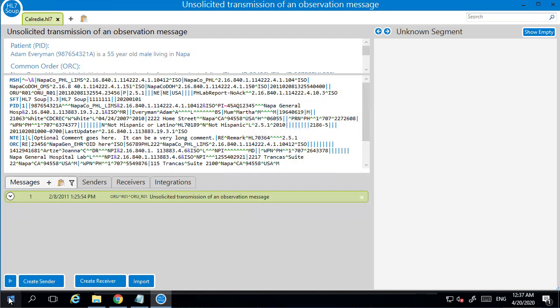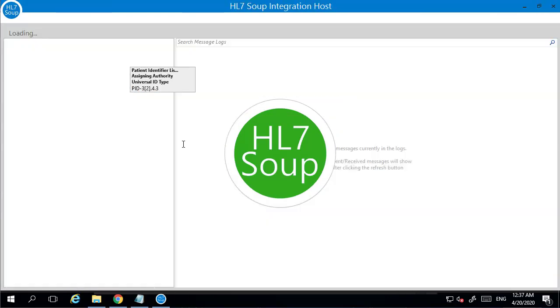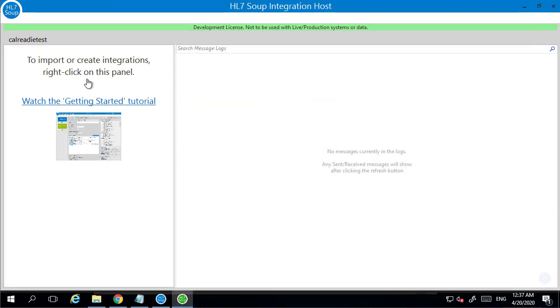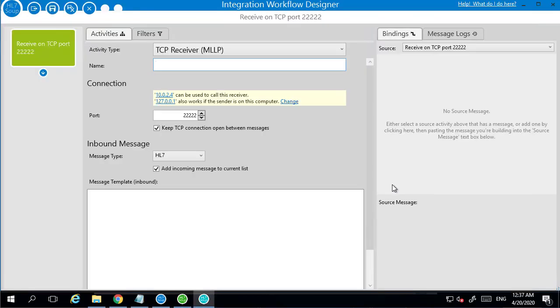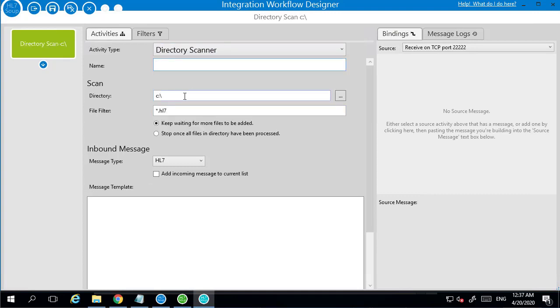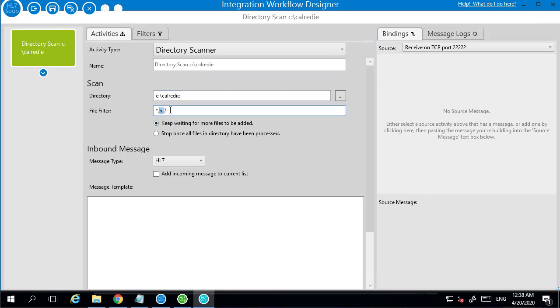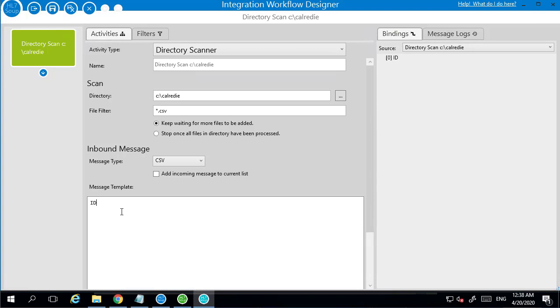So we'll start by loading up Integration Host. I've already installed Integration Host and I've got the development license in place, so I can now create a new workflow. We're going to be first of all converting our CSV file to HL7. So I'm just going to put in a directory scanner and I'm going to search for anything that turns up in that CalREDIE directory. We're going to be looking for CSV files. I'll change that to CSV and then we just put on a sample of that data.